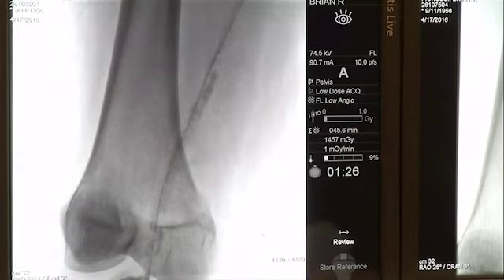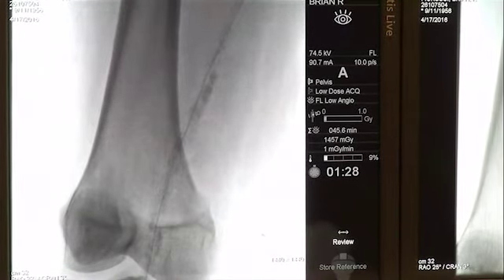You agree? Yes. I think the other option, of course, are focal force balloons, and the other would be ultra non-compliant with high pressure, something like a Kevlar-based balloon. Those will typically open these up. You mean like a Dorado? Yes. Yes.